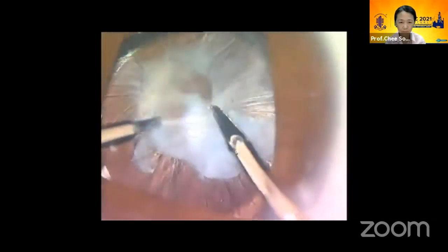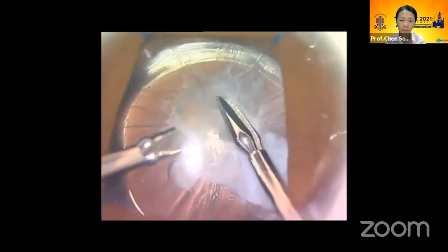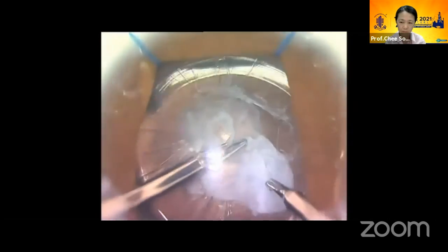At the time of surgery, you can see a really small opening in the capsule, and we inject that with dispersive viscoelastic to distend the capsular bag, and then grasp the anterior capsule with non-tooth microforceps and the fibrosis beneath with tooth forceps. We then gradually tease the scar tissue away from the anterior capsule, and what I do is not just tease it outwards but also downwards, and this makes the dissection much easier than if we were to just try to pull it forwards.